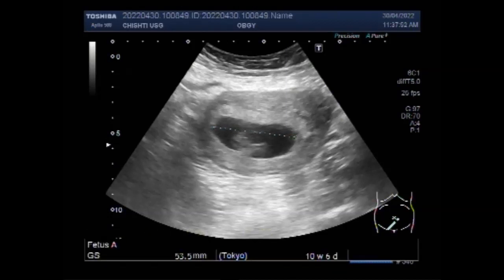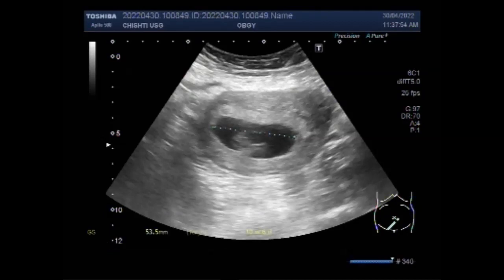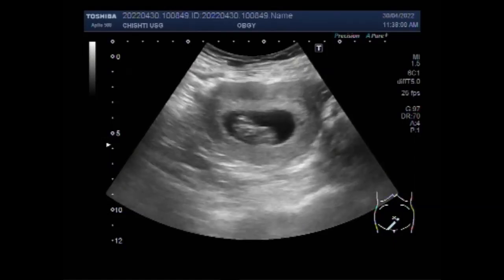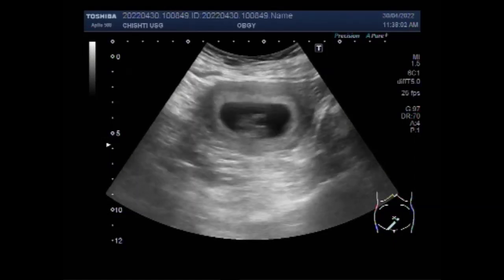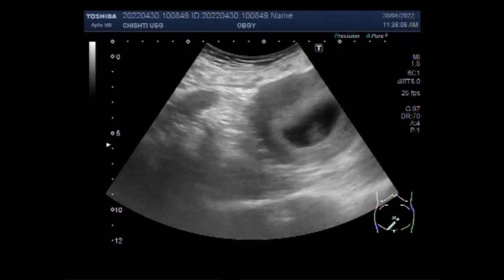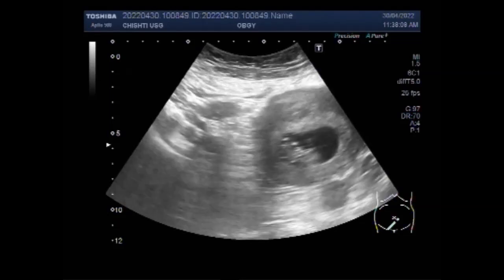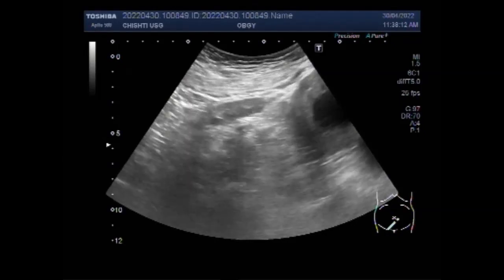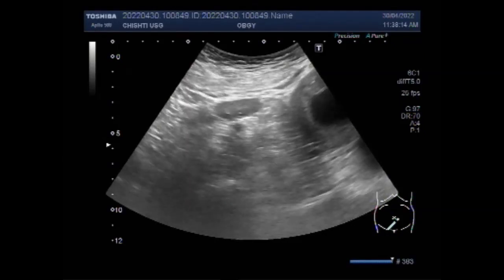Most ovarian cysts do not cause infertility. Cysts that become infected and cause a pelvic infection may cause scarring in the fallopian tubes, which could cause infertility; however, this is rare. Ovarian cysts that contain endometriosis may be associated with infertility. You can see the left ovarian cyst on screen.